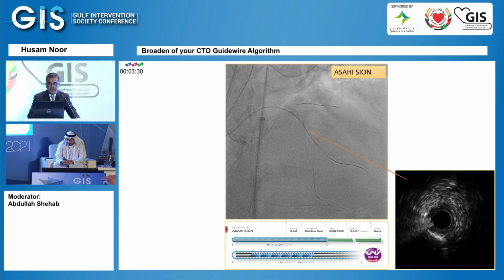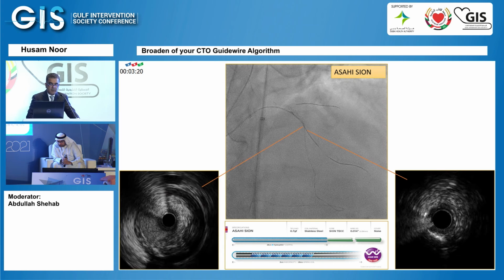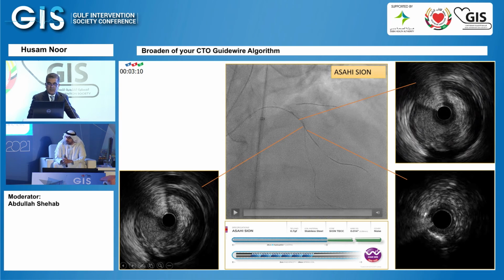So when I visualized here, in this segment, if you look at it, it's in the true lumen. So I know it's good. Pull back the IVUS, and you can see I'm in the false lumen. So this segment is false lumen. Still false lumen.